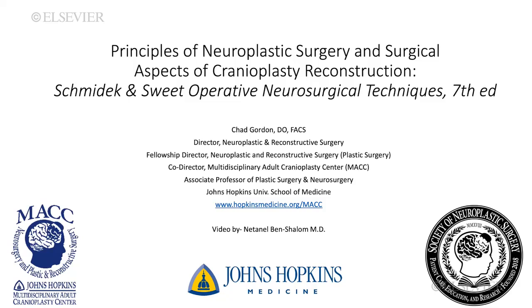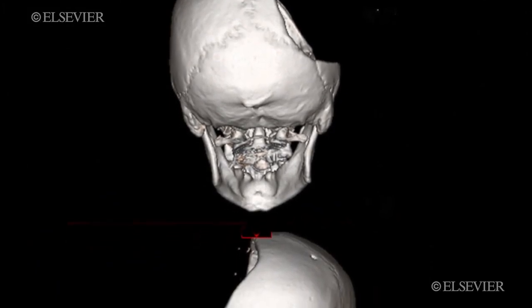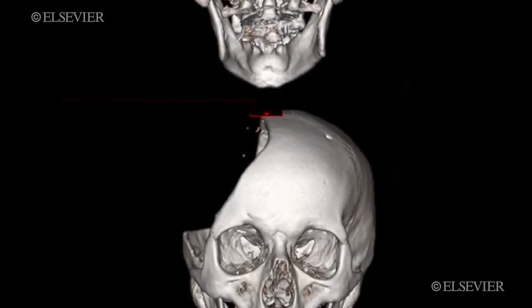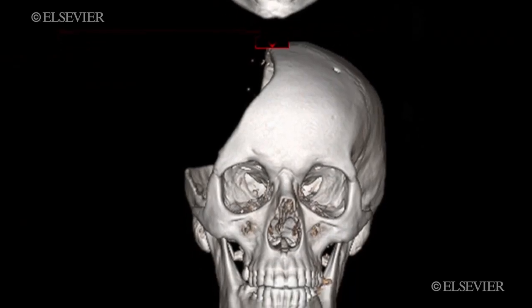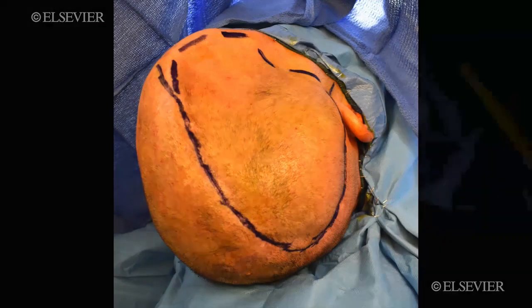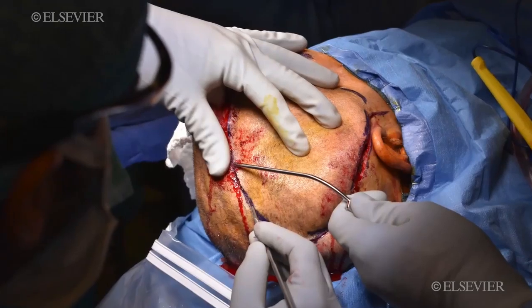This is a summary video describing the principles of neuroplastic surgery and surgical aspects of cranioplasty reconstruction. What you see here is a large right-sided hemicraniectomy defect with a major portion of the cranial skeleton missing. This is time of presentation for secondary cranioplasty with sunken scalp flap.